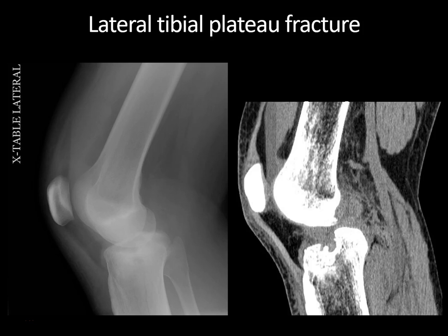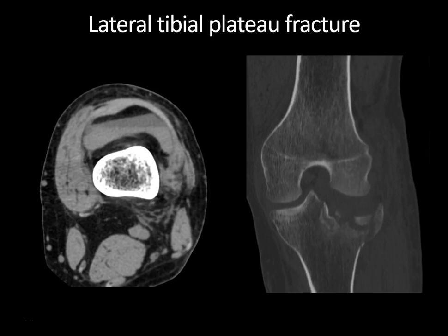CT and MRI have much higher sensitivity to detect lipohemarthrosis. On the axial CT image, the fat floats to the surface — least dense and most anterior. Then there's a hematocrit effect: blood separates into serum in the middle layer, and red blood cells, which are heaviest, settle in the most dependent aspect. It kind of looks like Neapolitan ice cream. Importantly, many tibial plateau fractures do not have visible lipohemarthrosis — they might just have hemarthrosis without fat. So the absence of this finding doesn't rule out an intra-articular fracture.